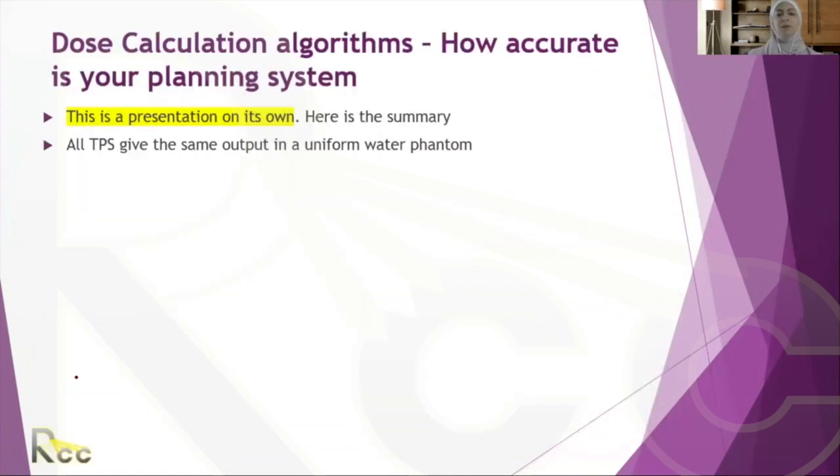I am almost finishing up with the ICRU lecture. This is not part of ICRU, but this is important for you to understand your planning system in general, because I don't want people to be too comfortable with what they see on the screen. What you see on the screen when it comes to treatment planning is highly influenced by two things.